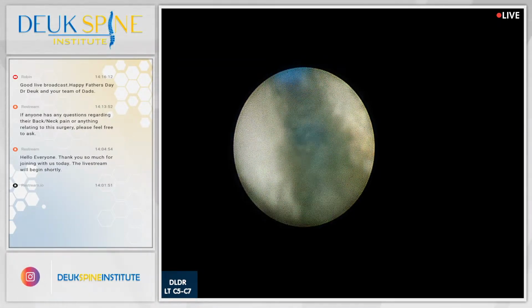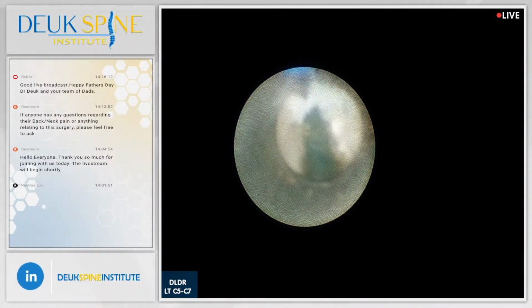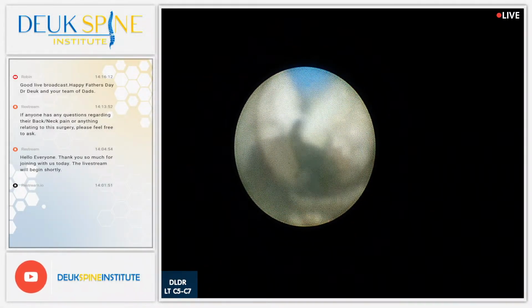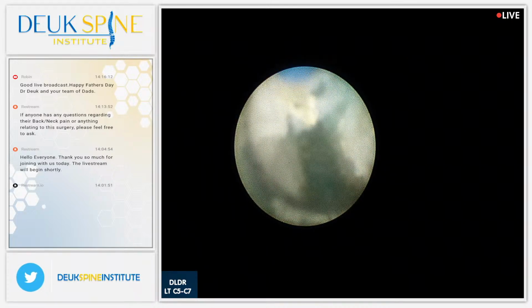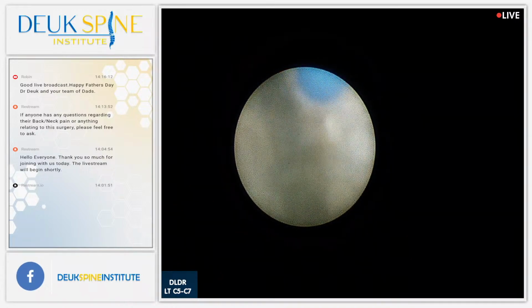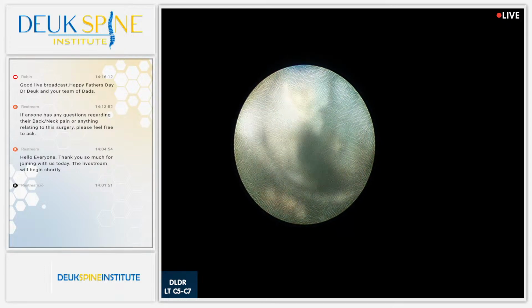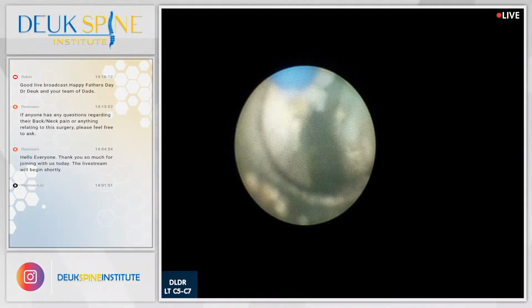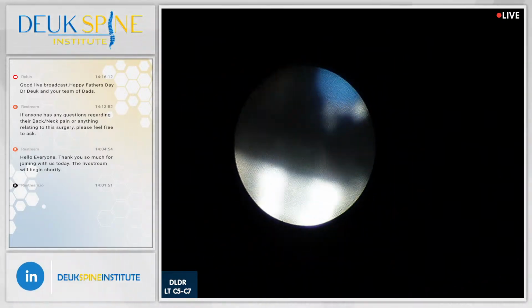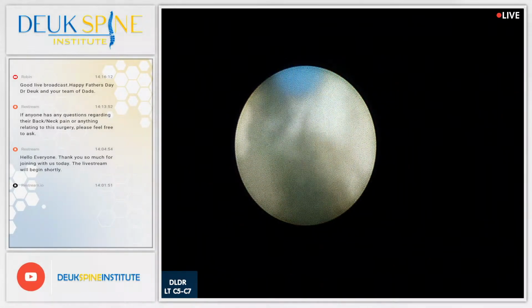I just don't see really any herniation left in here. I'm going to just pull back and look a little more to the side. There's a piece. I'm surprised there's not more scarred up herniation back here. I'm just wondering if maybe her symptoms are coming from a more recent herniation rather than old. Maybe they're more from the 6-7 rather than the 5-6. They both needed to be fixed. No doubt about that.